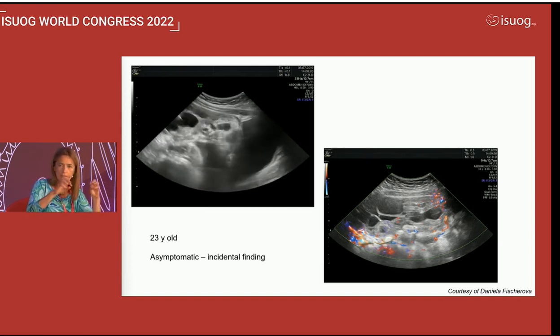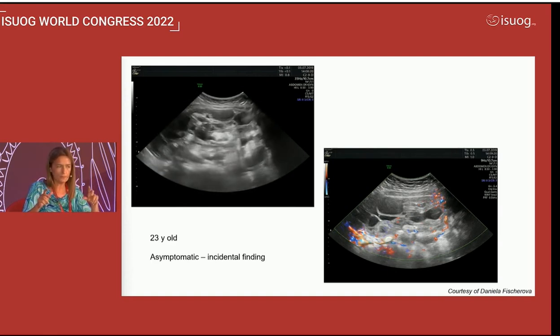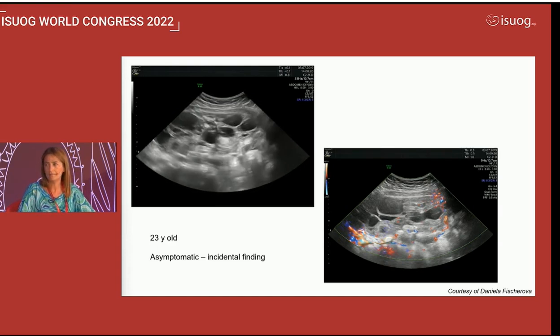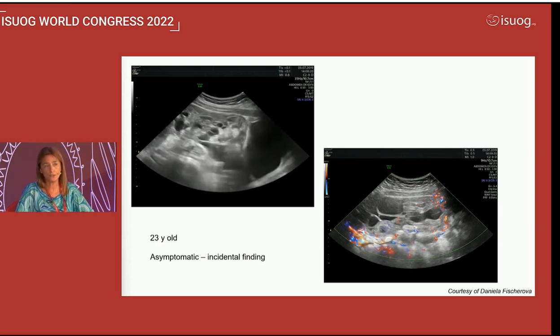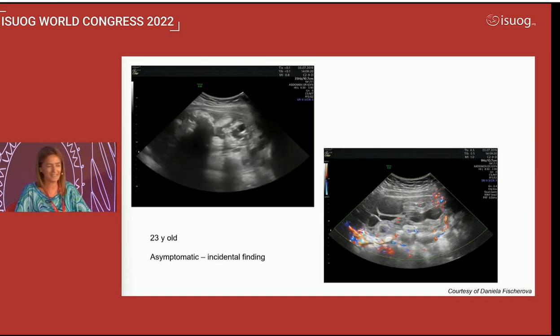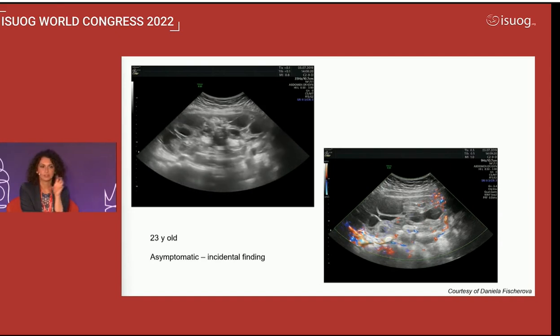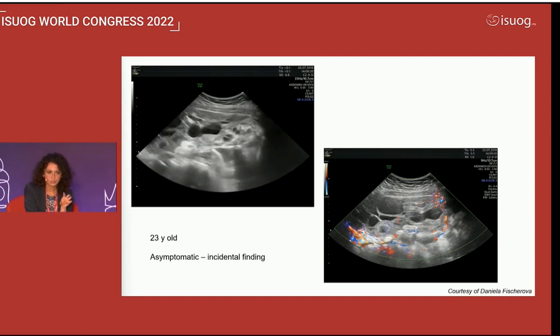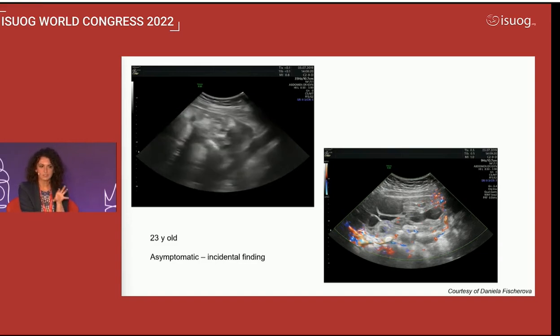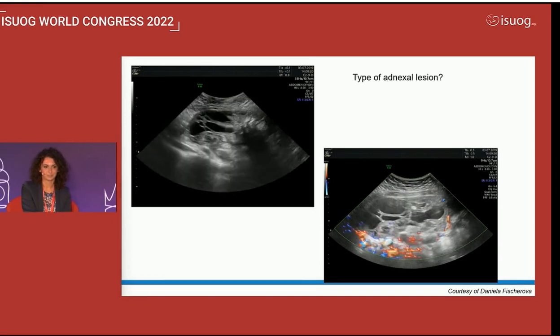Again, irregular, different, and to me, I hope to be right, it corresponds to the presence of neuroepithelium. And so another germ cell tumor, immature teratoma. Keep in mind this echogenicity, this image of anechoic cystic structures with these hyperechoic areas, with these acoustic shadows, because this is the most typical characteristic of the immature teratoma.